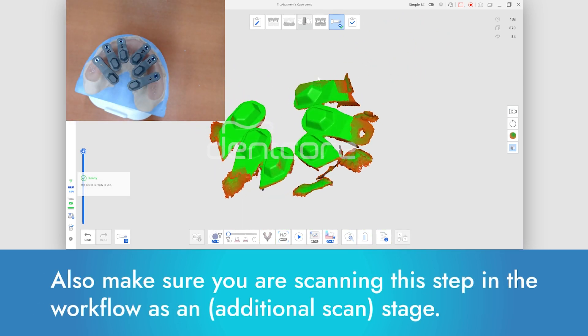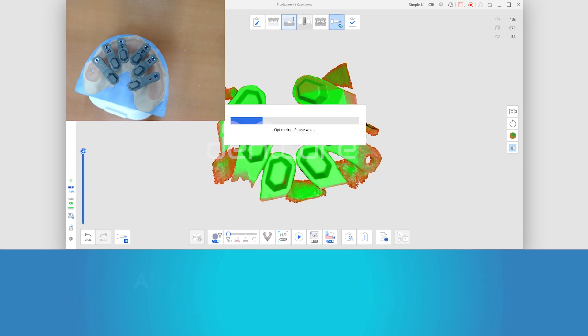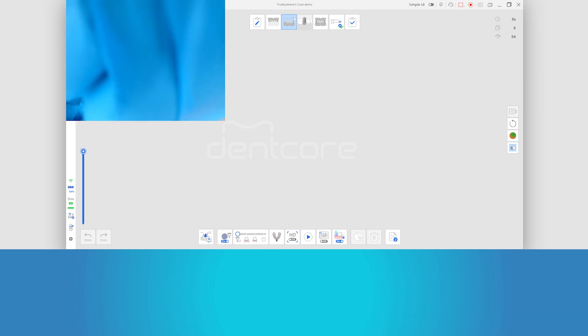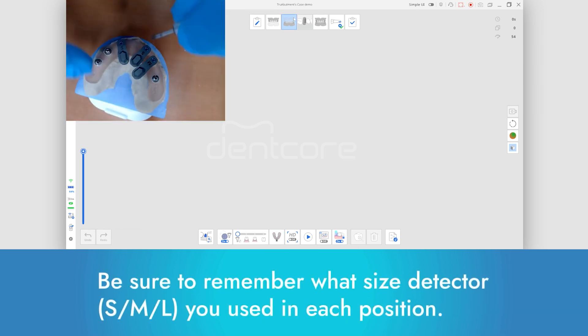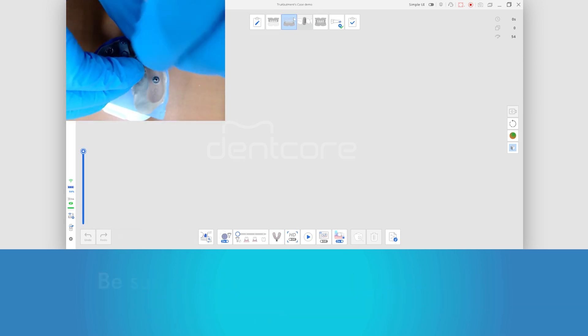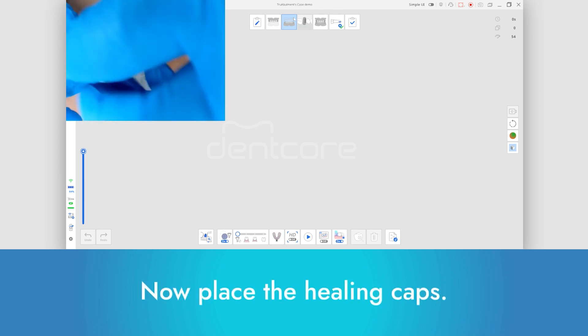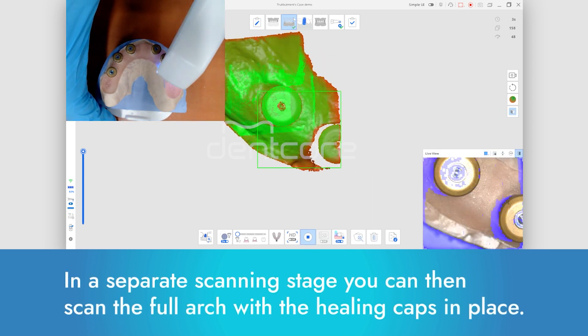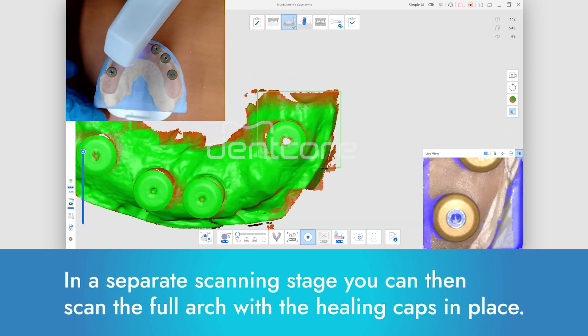Make sure you are scanning this step in the workflow as an additional scan stage. After you have scanned, you can now remove the MUA detectors. Be sure to remember what size detector you used in each position. Now place the healing caps.